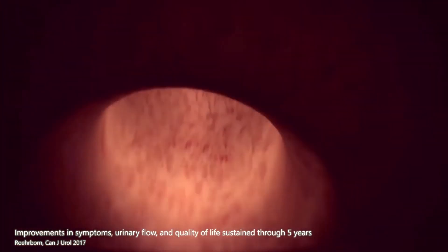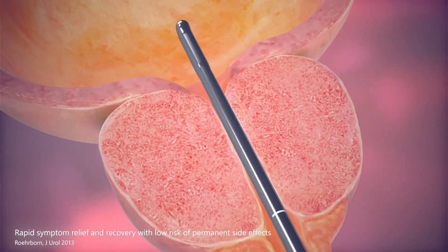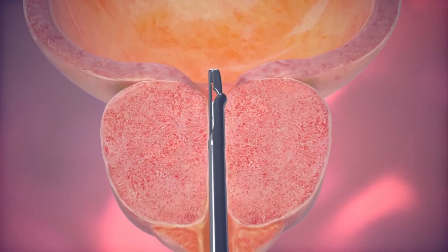The UroLift System treatment is often performed in a clinic setting under local anesthesia. The procedure begins by inserting a delivery device into the urethra. An inserted cystoscope provides the physician with visibility to the anatomy.